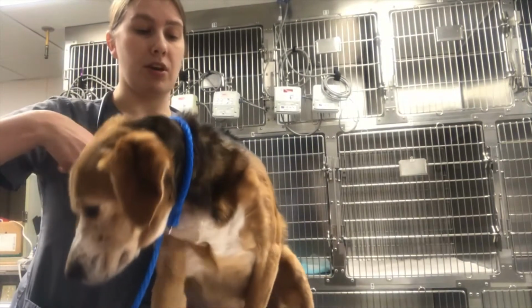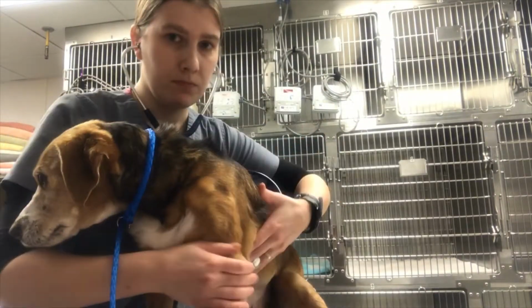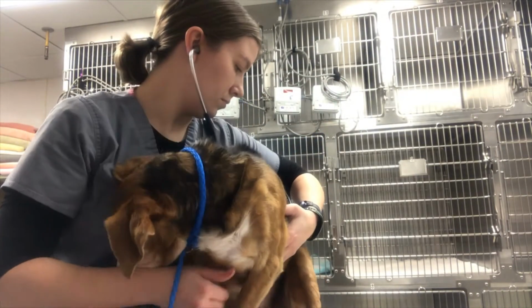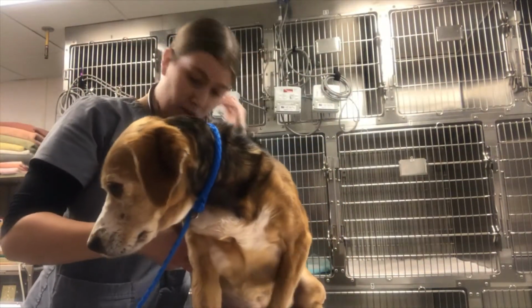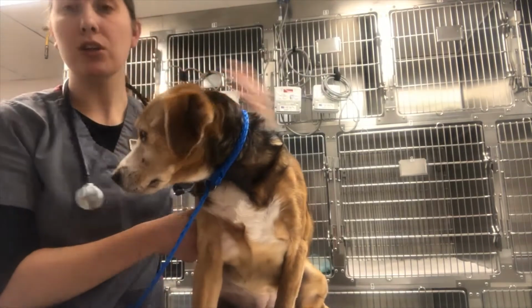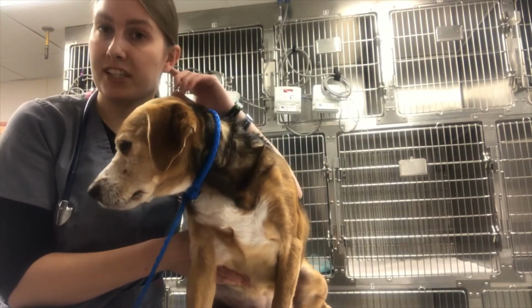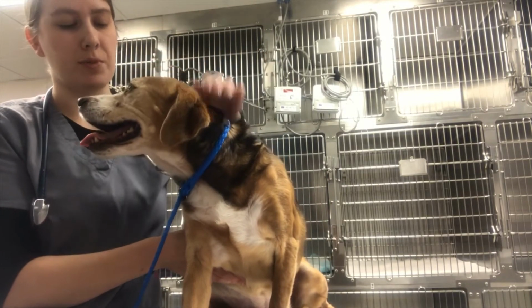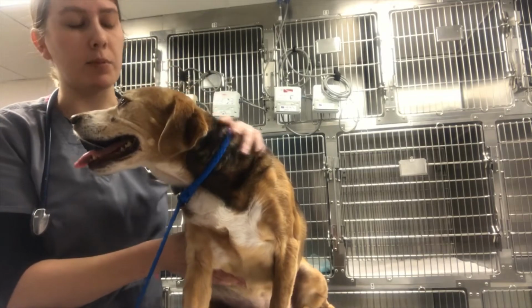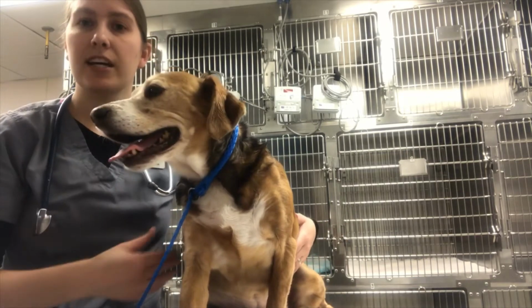So now I'll begin on the left side, and I'll also begin and listen on the right side as well. Alright, so upon listening to her heart, there was a clear lub-dub sound. Her heart rate was about 100, so I counted 25 beats in a 15-second span there. Definitely a little bit nervous, but that's okay. She's in a new environment, so that's always something that we take into consideration too. I didn't hear any swishing sounds.